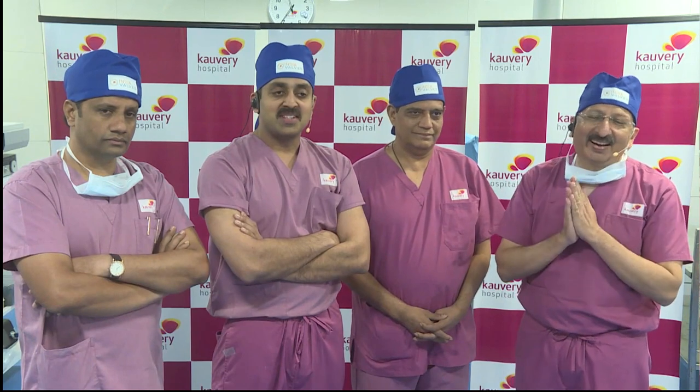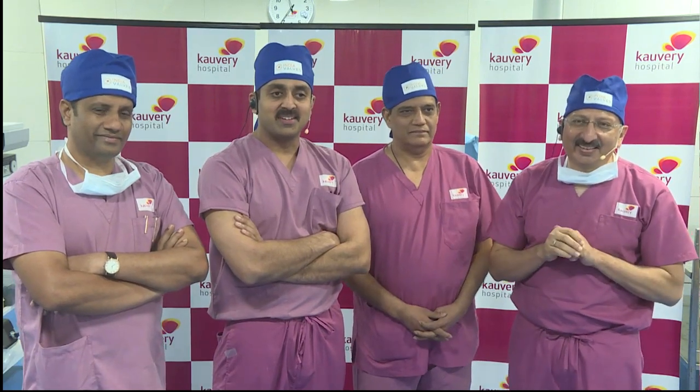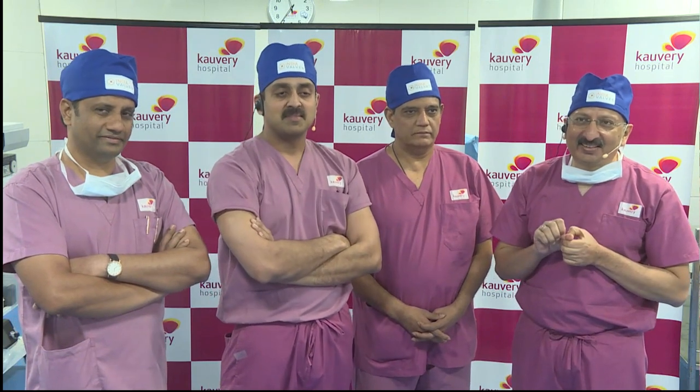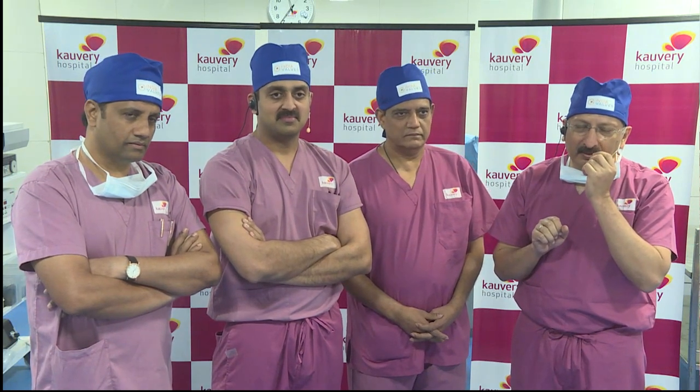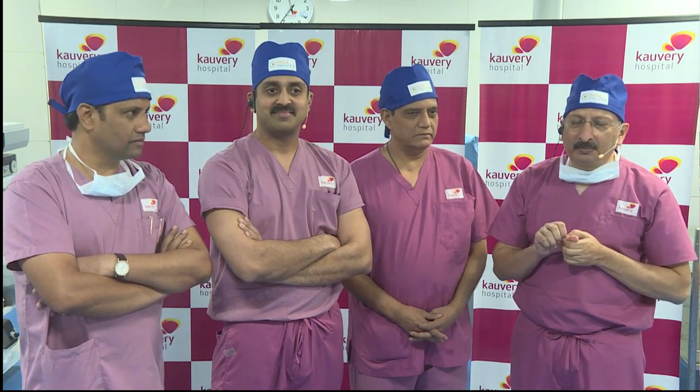Well, it just gave that extra piece of reassurance that we know roughly where it is. Actually, I've done cases with the second pigtail, it's never helped me. What is important is just to focus on the non-coronary aspect. In fact, Saibal, in one patient, we could not put the pigtail, so we put a wire there. I have done a case from a carotid approach. There was no other approach, and I had to use just a wire in the non-coronary cusp, and that was good enough to implant the valve.